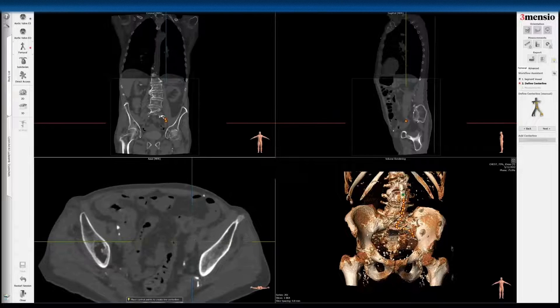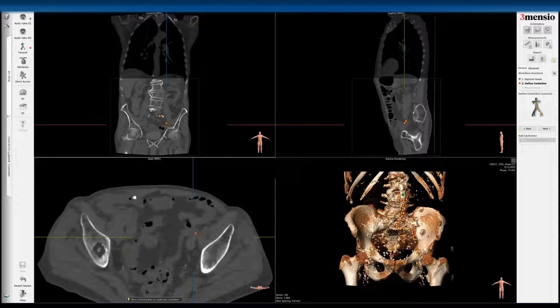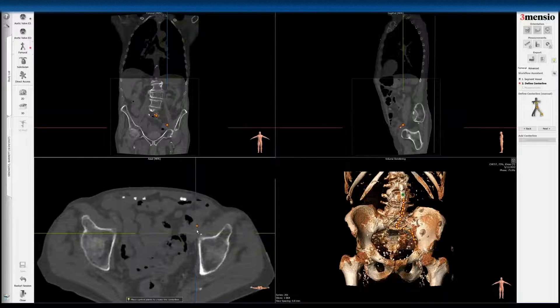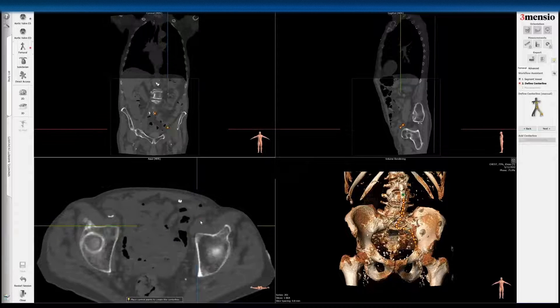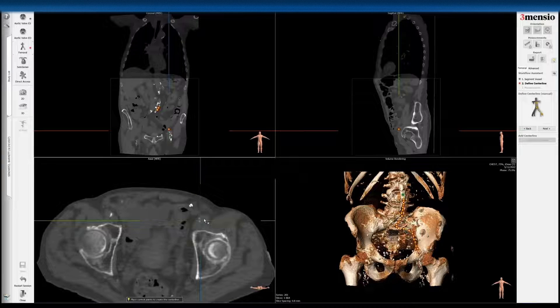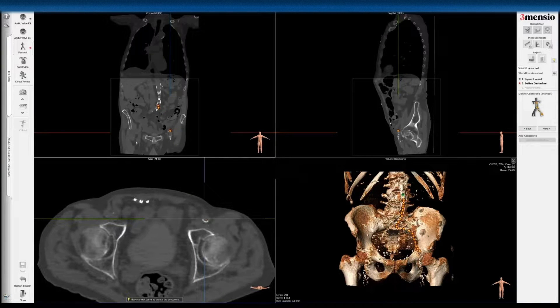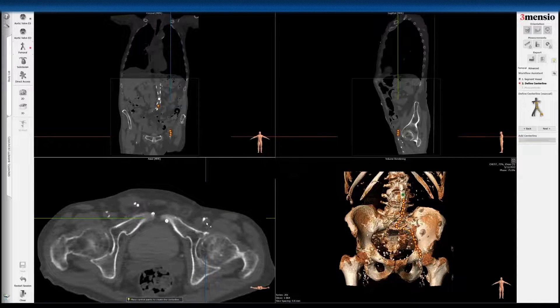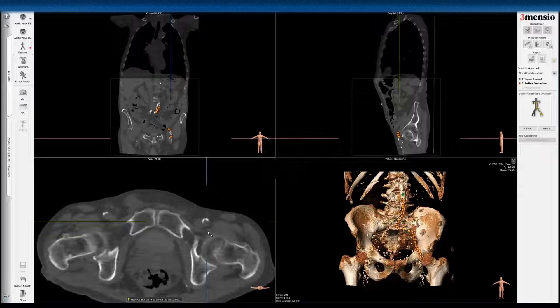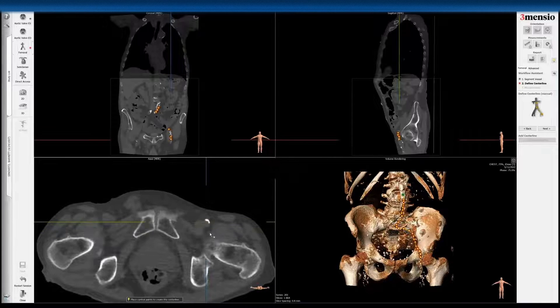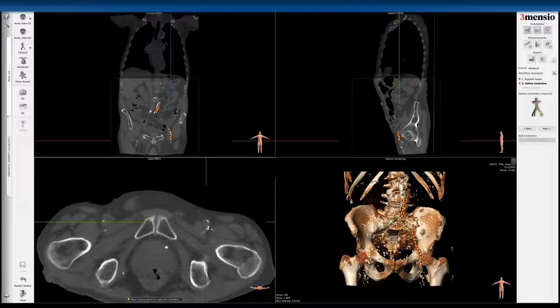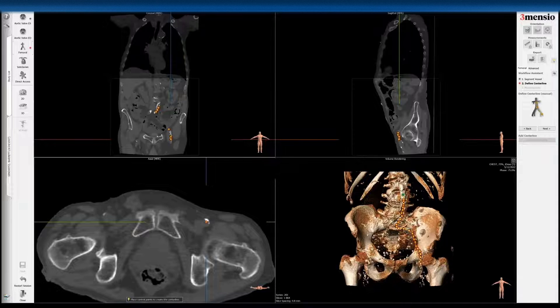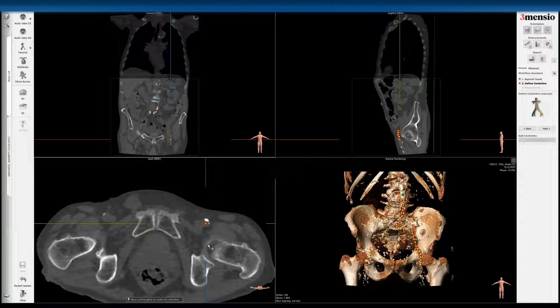Now, one thing that you need to be mindful of when tracing this is that because it's a non-contrast scan, you don't see the luminal diameter. There's some calcium on the vessel wall, so your measurements may be a little bit overestimated. The vessel might actually be a little bit smaller than you think because of the calcium wall — you may not see the lumen itself. Any focal dissection or atherosclerotic plaque, you're not going to be able to see; it's not going to light up.